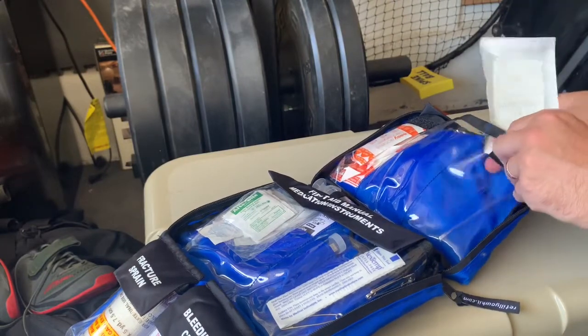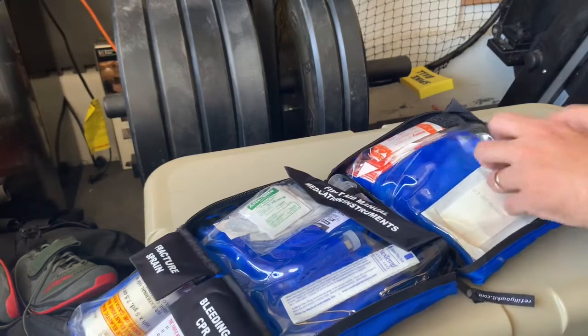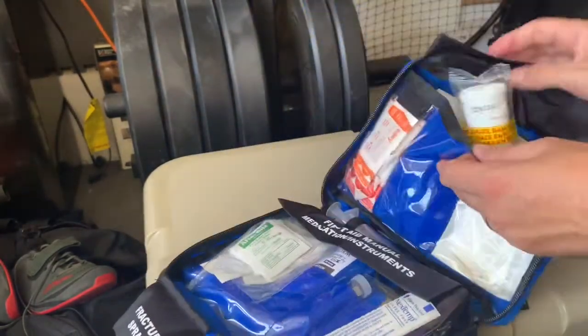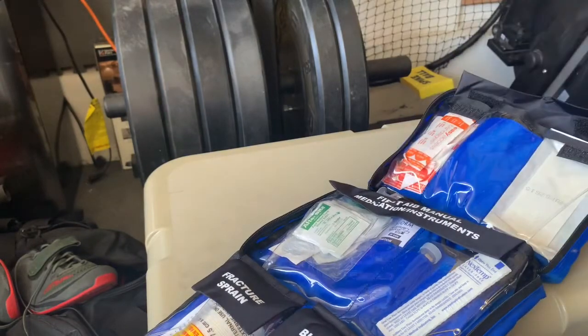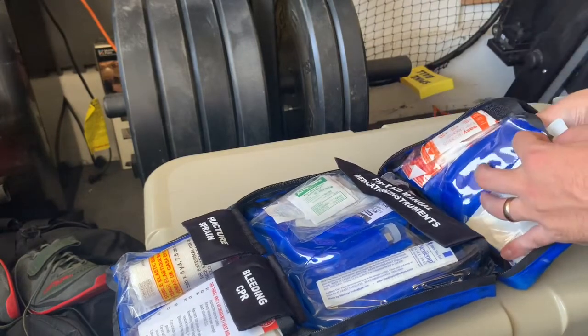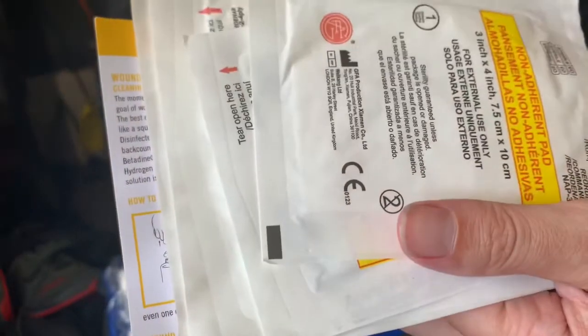That's really useful to have — if you use axes or big knives to process firewood, you never know what might happen. I've also got a nice roll of duct tape in here, and there's a back pocket with a few things. Along with the duct tape, we have white cloth adhesive tape and roller gauze. Gauze bandages can be used to cover burns or to pack a big gaping wound that won't stop bleeding.